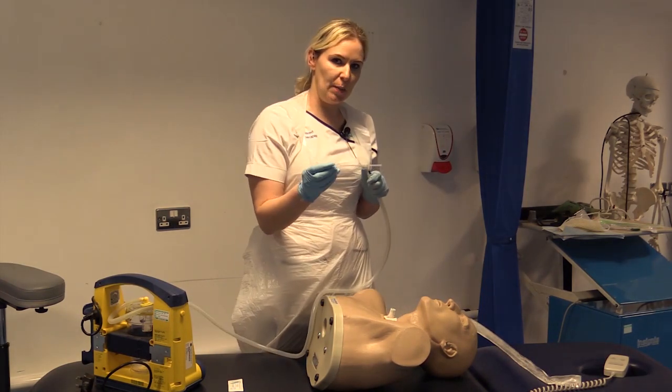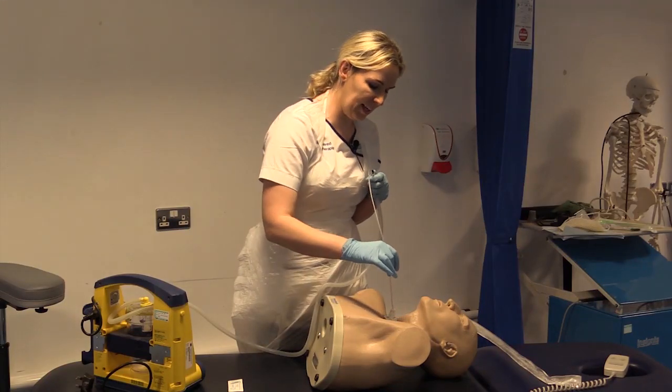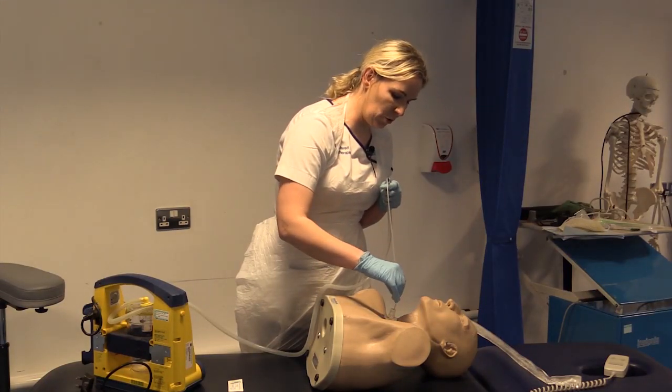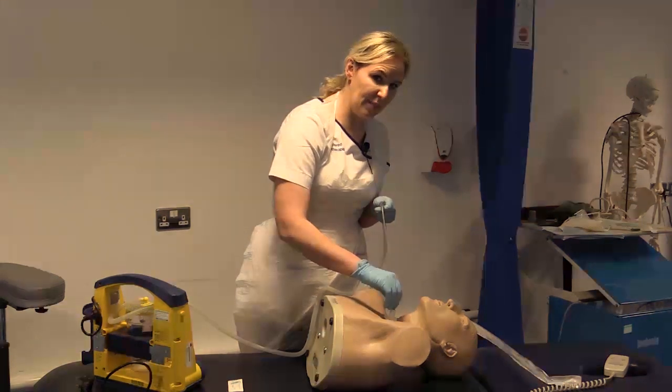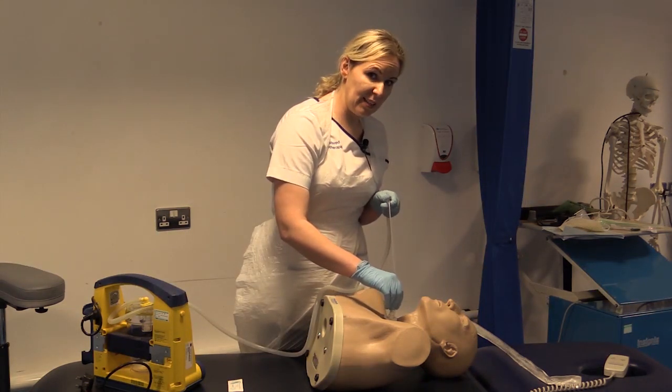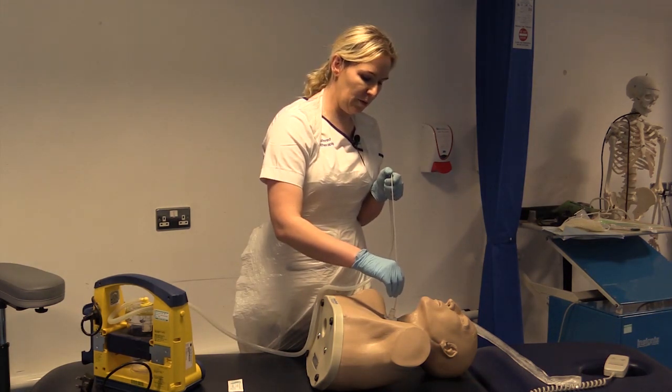Okay, again, you're going to explain to your patient that suction is going to occur. You gently insert your catheter into the trachea, and again, you're going down nice and slowly, and you're looking for that cough or to where resistance is felt. If you feel resistance, come off about 1 centimetre, apply your suction, and slowly remove your catheter.